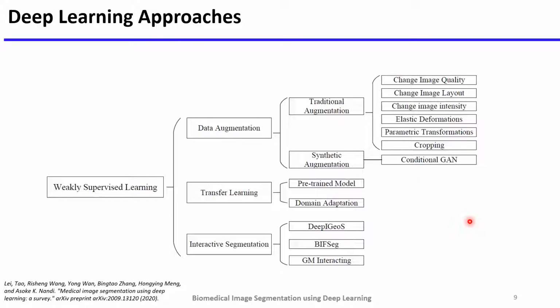So interactive segmentation allows clinicians to interactively correct the initially segmented image generated by a model to obtain more accurate segmentation.